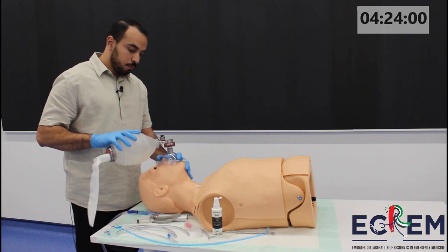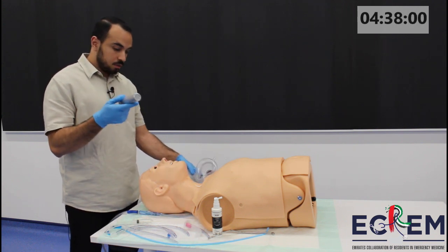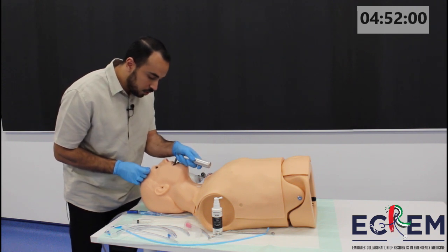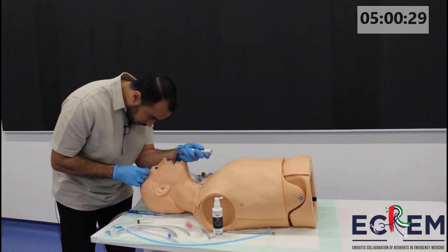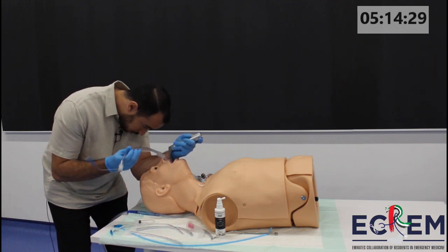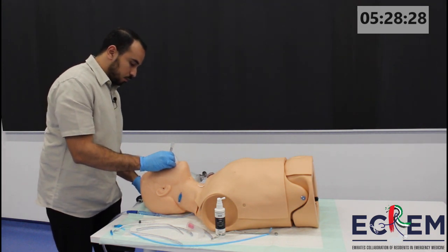We'll try and maintain a C and E shape over the mask so that we can get good chest rise. Patient is adequately paralysed. In this case, we will proceed with our intubation. We'll have our direct laryngoscope — we have already checked that it is working and the light is working. We'll insert it laterally and then get it in the middle while pushing the tongue away, lifting up, making sure we're not hurting the teeth, aiming for the tip of the laryngoscope to be at the vallecula so that we can see the vocal cords and the anterior part of the trachea. Now we're going to proceed with the tube. The tube is usually placed at 22 to 23 centimetres in a male.